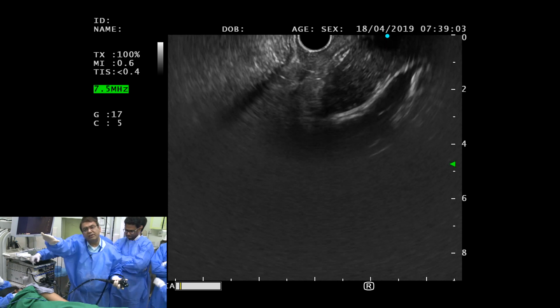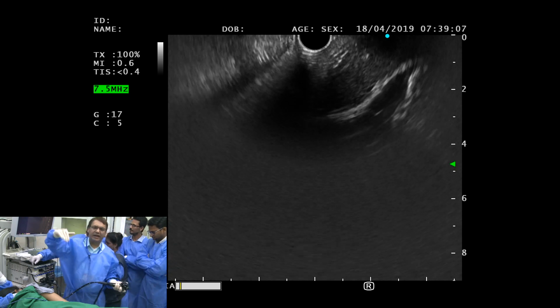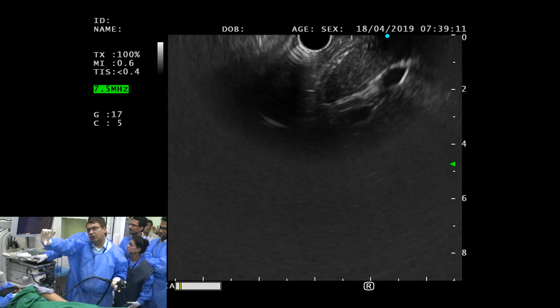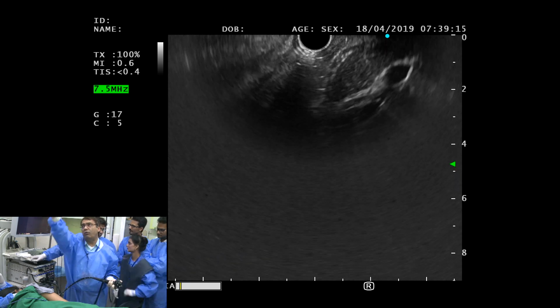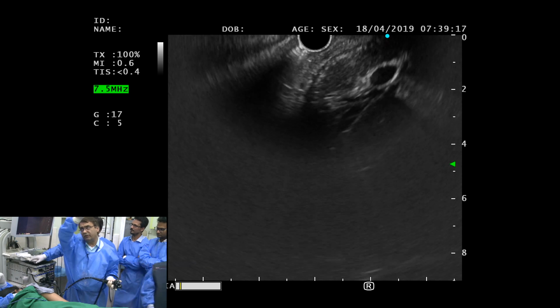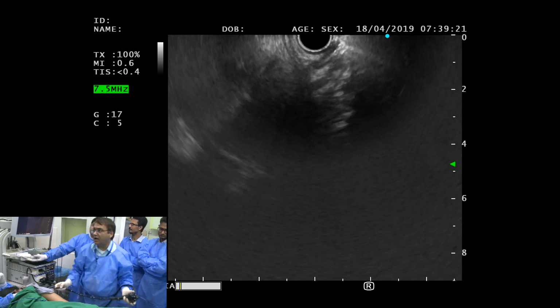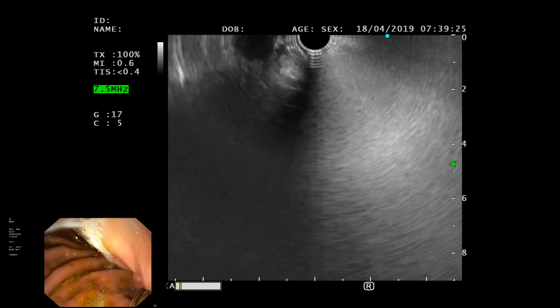That would be an ERCP scope. For the EUS, the camera is at a 45 degree angle, at least with the Olympus scope, it's close to 45. So you are looking at the junction of the ceiling and the wall, where the corner is, where they meet, and moving forward. That's how I give an example of EUS scope movement and camera.